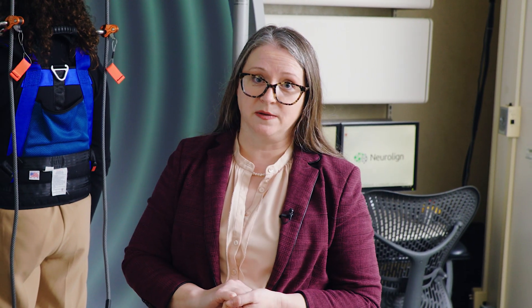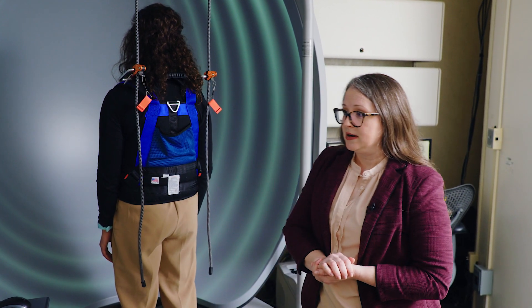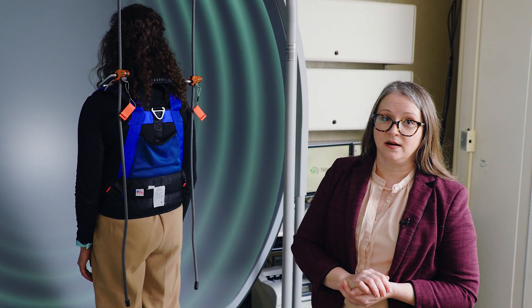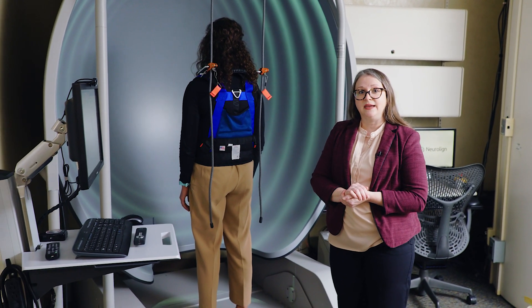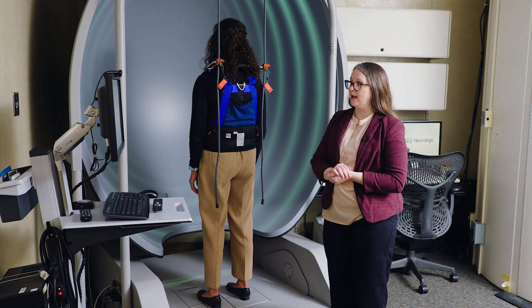We'll then repeat that condition with eyes closed, which is a very difficult condition for those with sensory deficits, but also if your inner ear isn't working as well. The final condition is a culmination of all of these components. In this condition, Sarah's eyes are open again, but now both the floor and the visual surround are unstable. This requires her to use all of her sensory information to suppress both the abnormal visual and somatosensory — or floor — information to keep her balance.